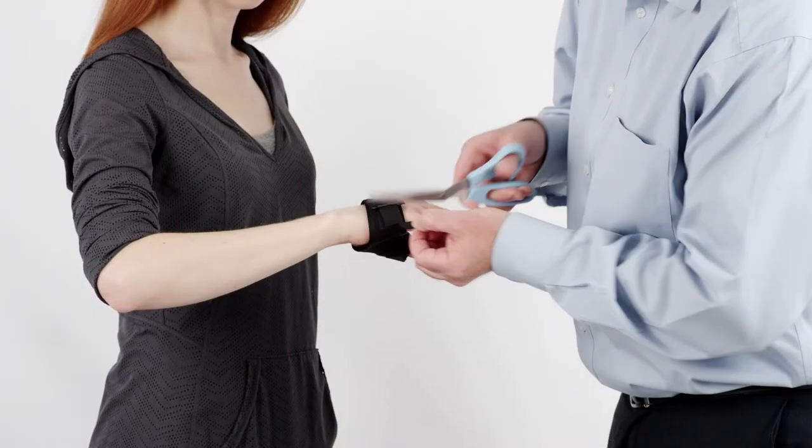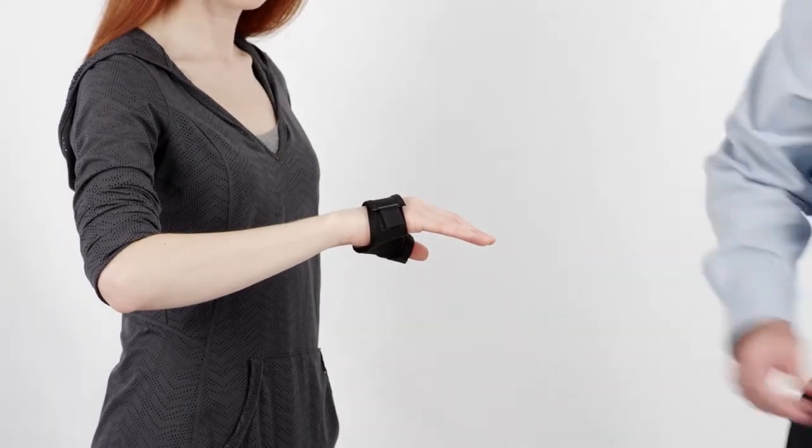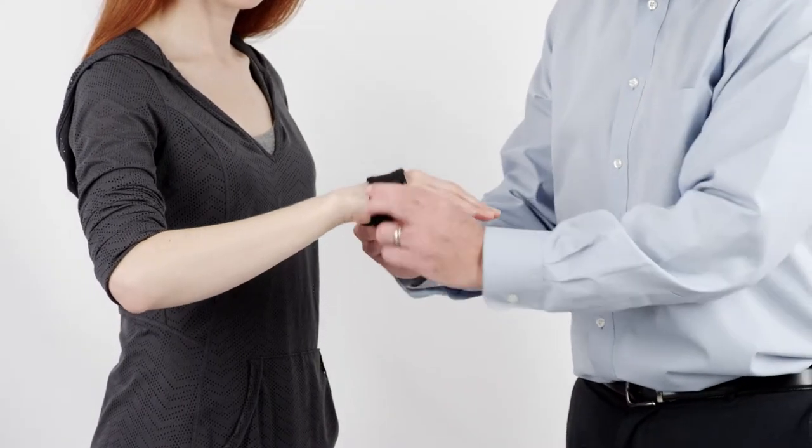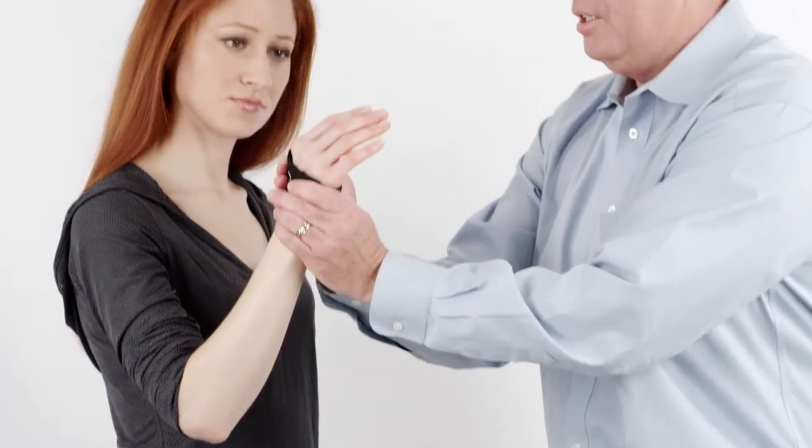Excess hook and loop can be trimmed if necessary. As always, please give each patient the care instructions included with their brace.